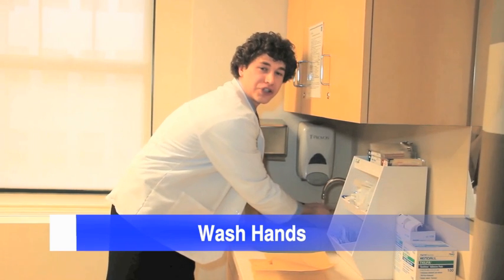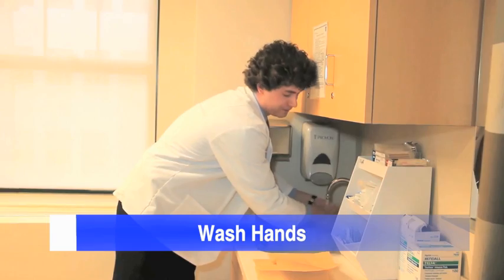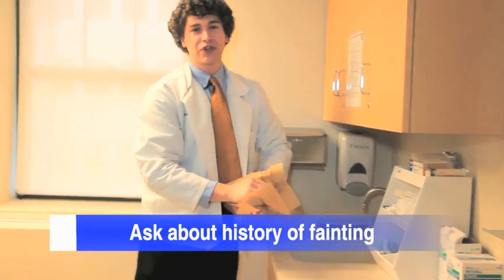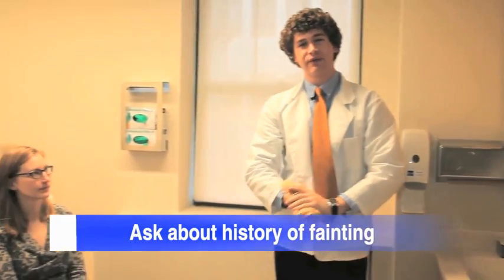Begin by washing your hands with soap and water. Be sure to ask the patient if he or she has ever fainted while giving blood. If they have, ask them to lie down while the procedure is being carried out.